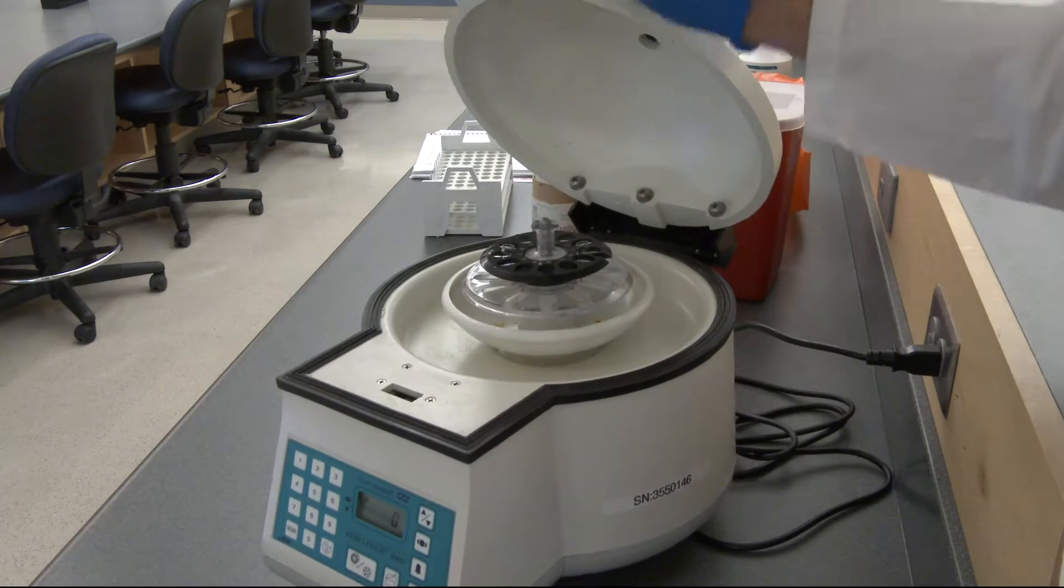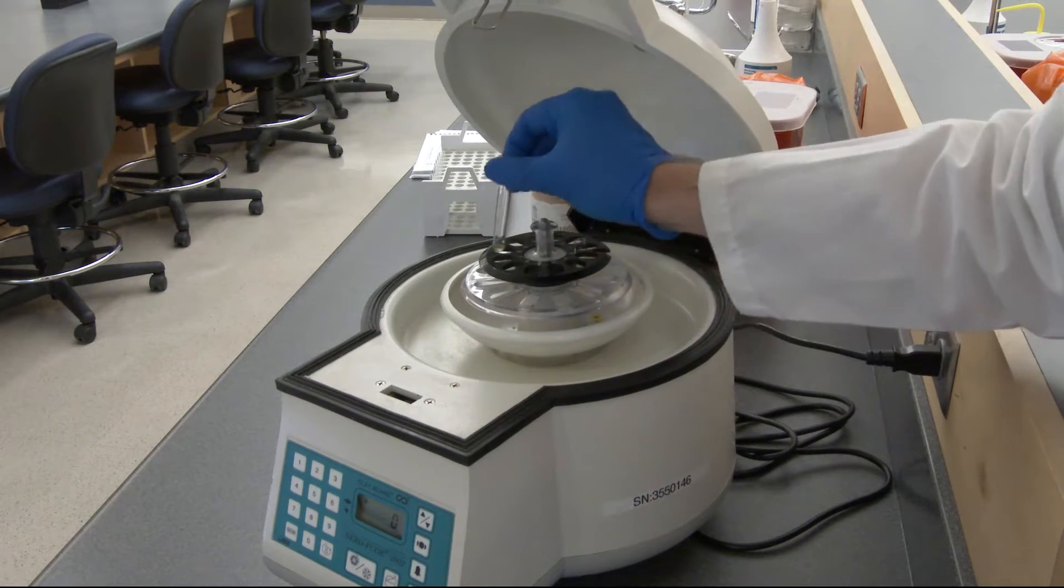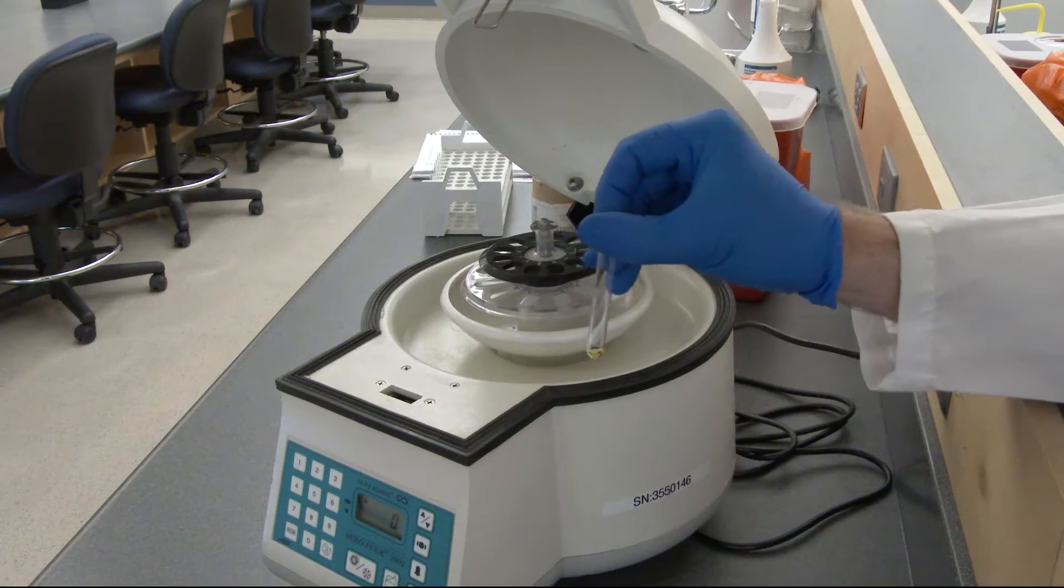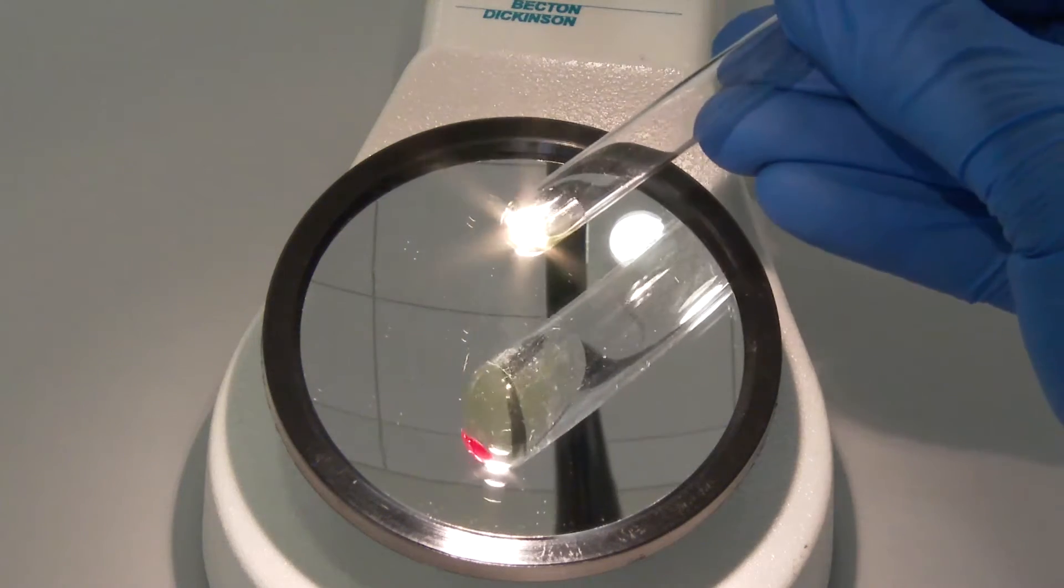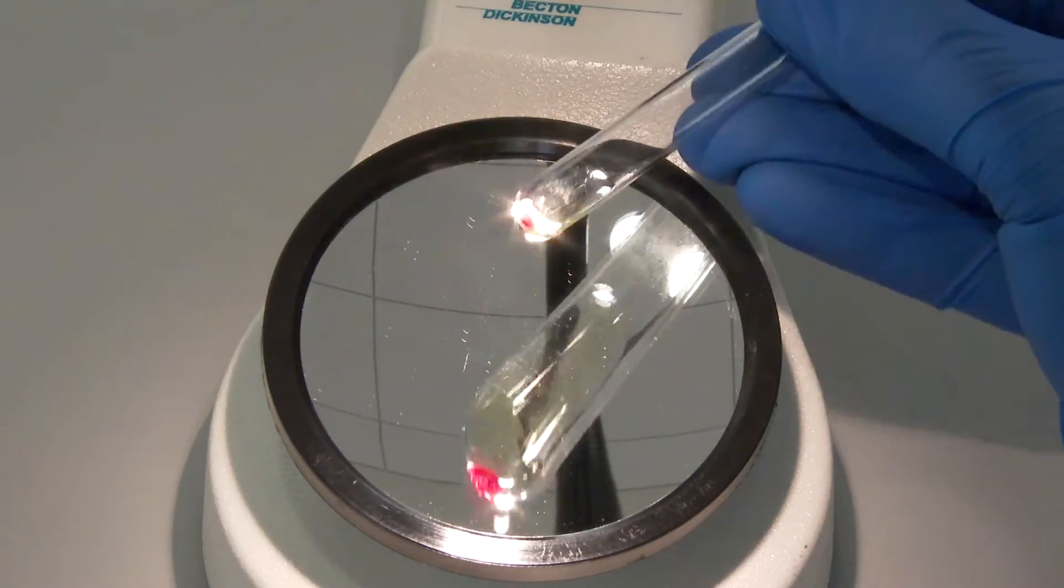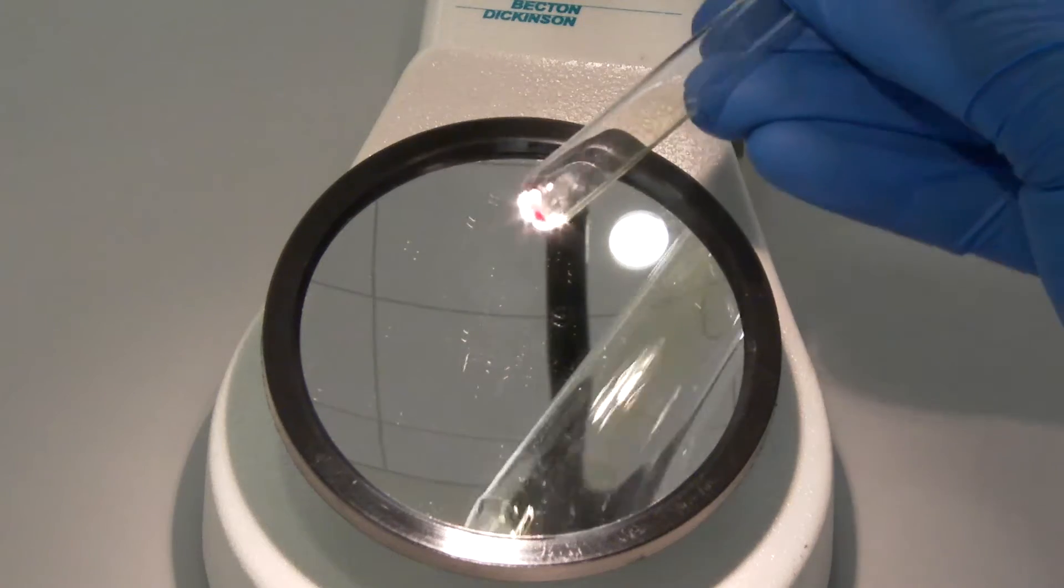When you pull the test tube from the centrifuge, hold the test tube with the open end between your thumb and index finger. Move the tube between the magnifying mirror and the light. Tilt the tube horizontally with the cell button facing up.